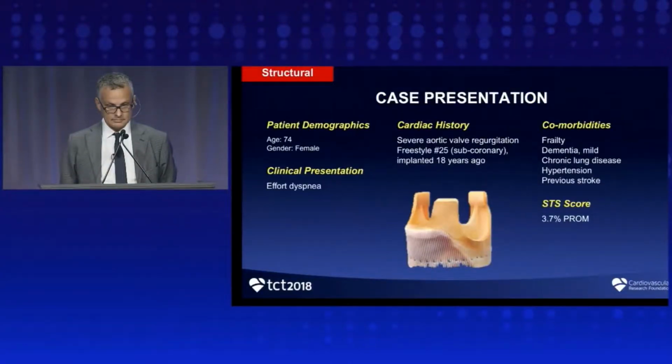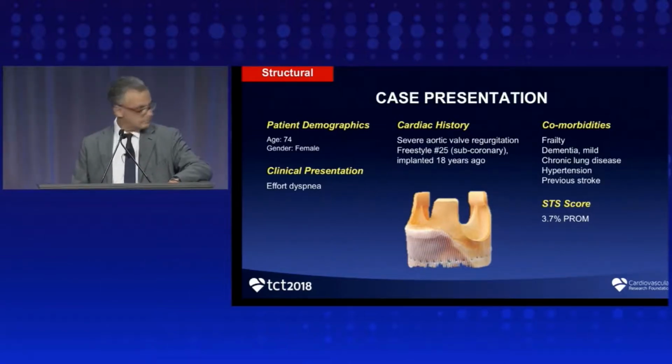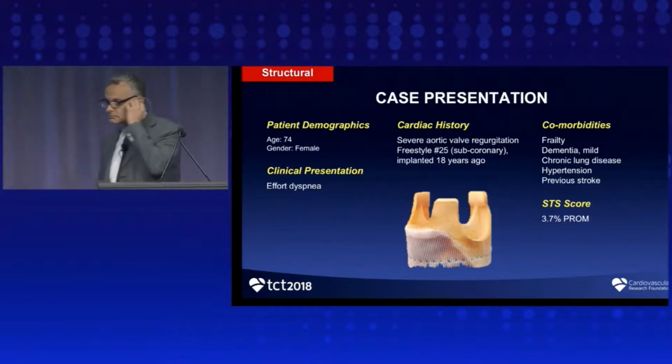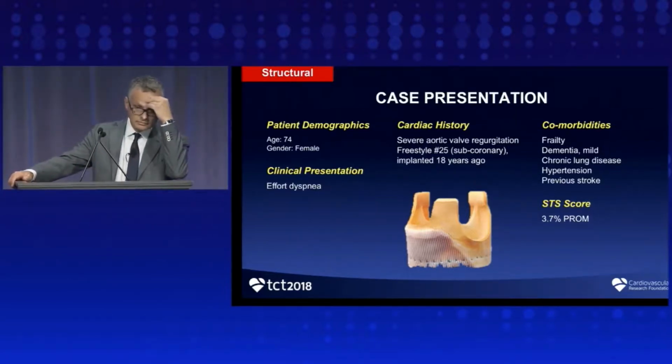So our patient is a 74-year-old female who presents with exertional dyspnea. 18 years ago, she had a Medtronic Freestyle number 25 aortic valve placed for severe aortic valve regurgitation. Her comorbidities include frailty, mild dementia, chronic lung disease, hypertension, and a prior stroke. Her STS score is 3.7%.